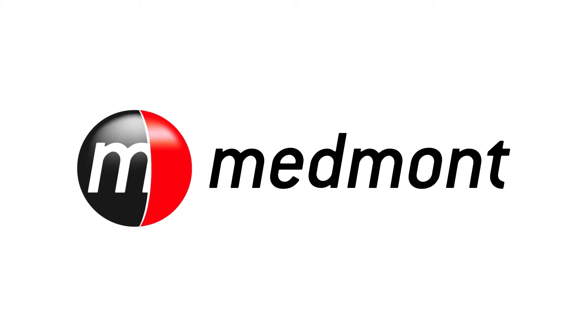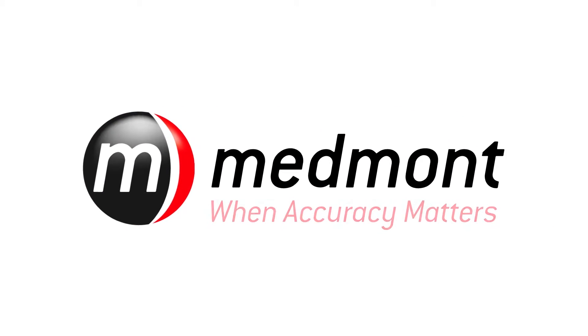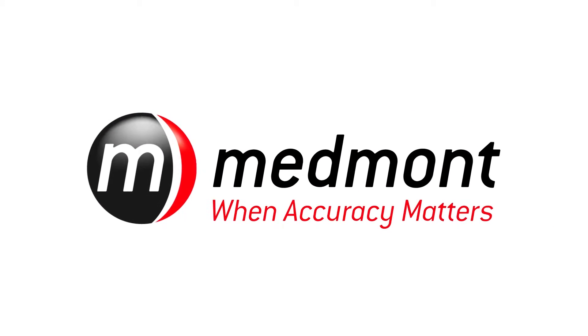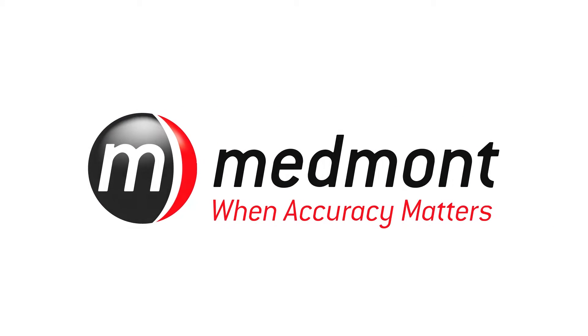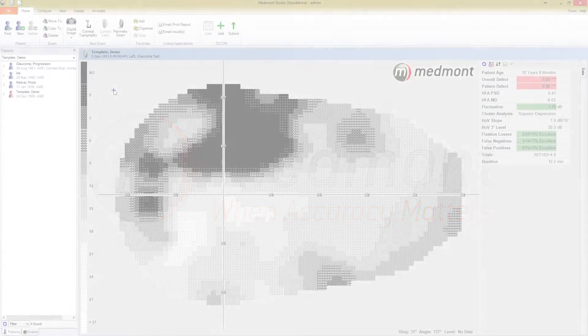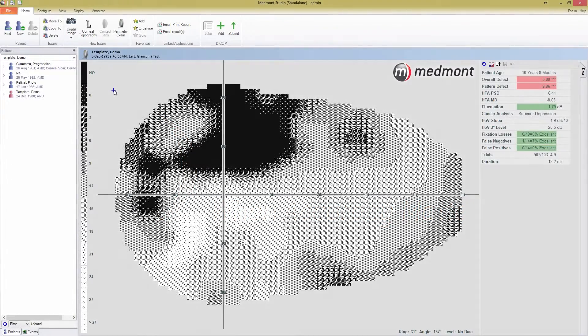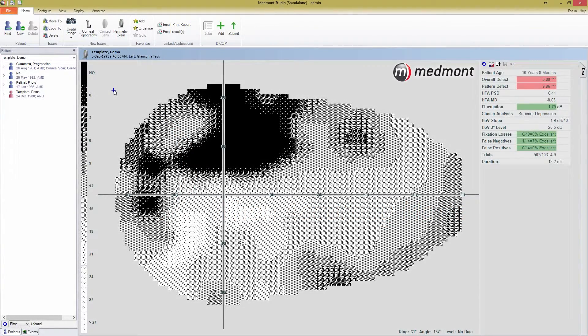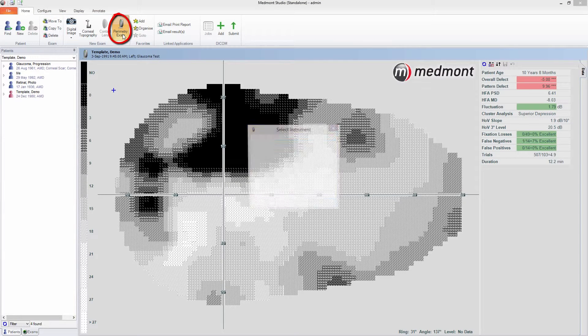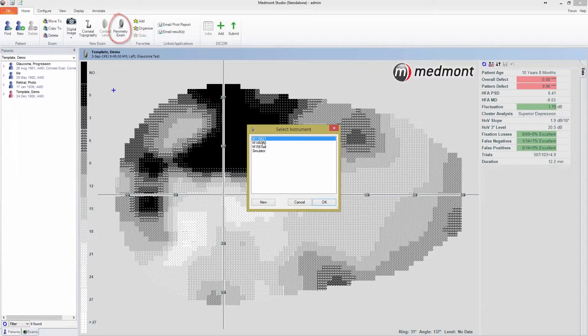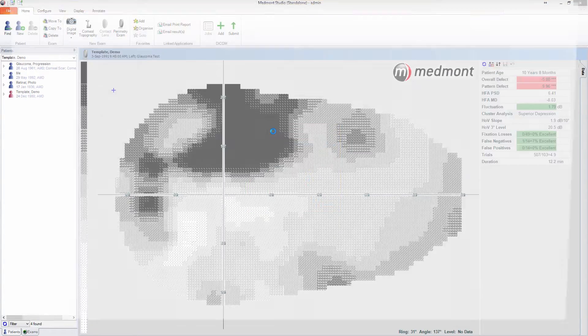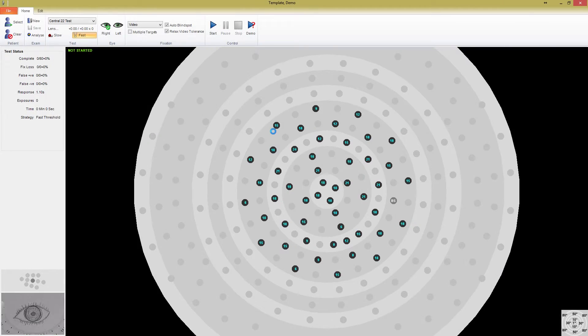Hello and welcome back to Medmont's M700 tutorial videos. In this video, I'm going to discuss the test window home screen in more detail, as well as the basics of the editing tab and the various ways you can modify a test while it's running. To get started, press the Perimeter Exam button and select your instrument if you don't already have a default set.